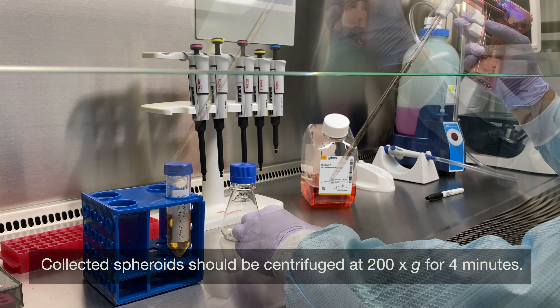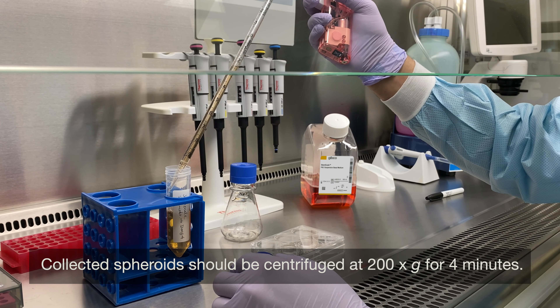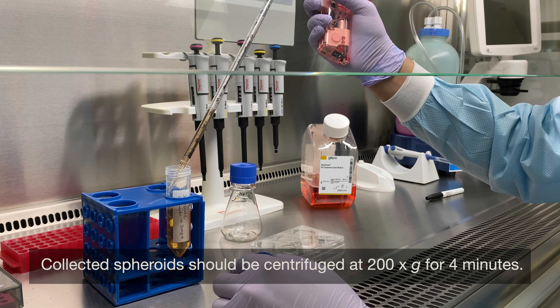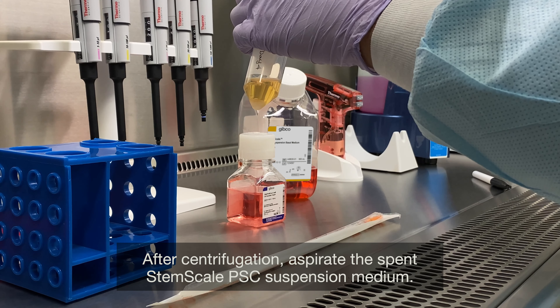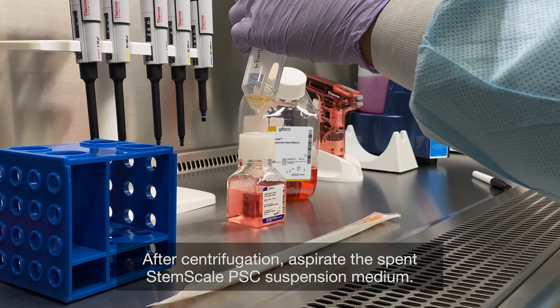Collected spheroids should be centrifuged at 200 times gravity for 4 minutes. After centrifugation, aspirate the spent StemScale PSC suspension medium.